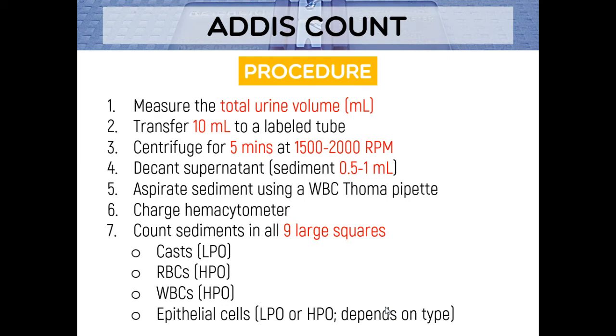Because again, these 4 are very much indicative na gyud of renal disease. Okay? Because again, di ba, mga casts, samot na kay casts, gikan gyud sa kidneys, RBCs, WBCs, bleeding or infection, and epithelial cells, example, if mga RTEs, so gikan gyud sa kidneys. So again, naka-focus ani na four ka cells because again, they are quite indicative na gyud og renal damage. Okay? All right. So what we do is again, start sa tag usa ka sediment or usa ka element, example casts under LPO.